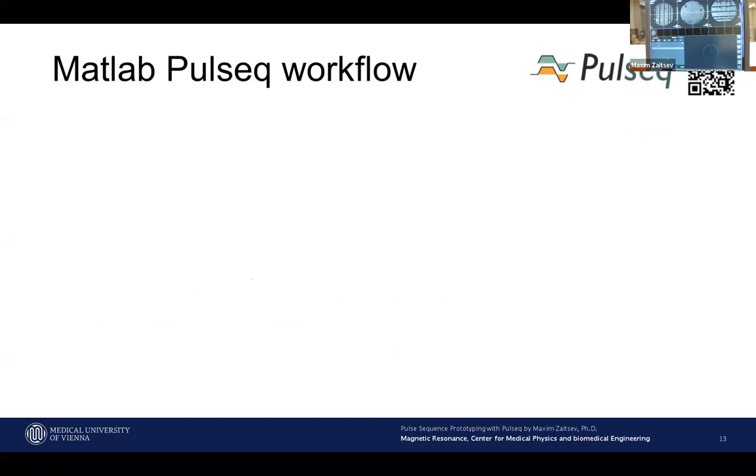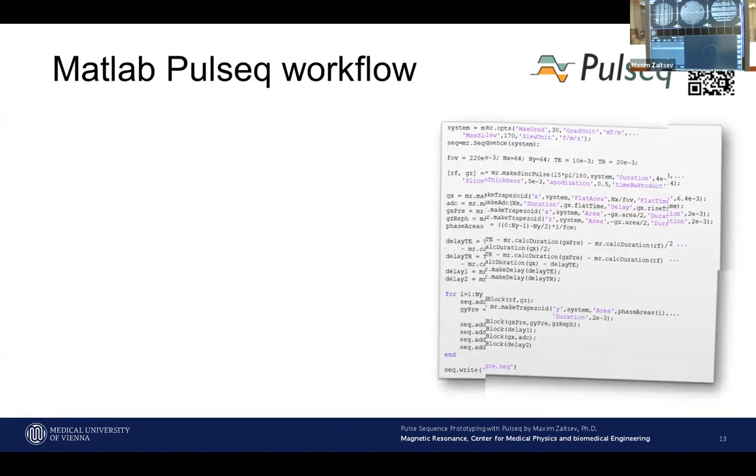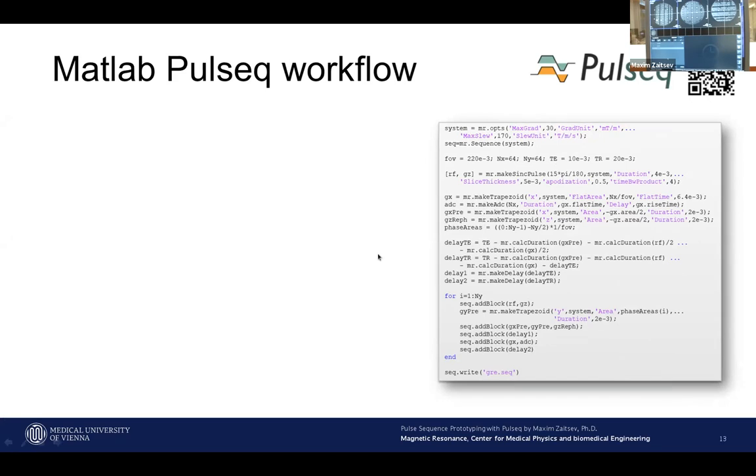So how does it look in MATLAB? Basically what you do is just write a little MATLAB script, and for people programming under Siemens, believe it or not, this is a runnable sequence. It's very minimalistic, it's not ideal. It will maybe have some artifacts due to insufficient spoiling, for example, but it will produce an image.